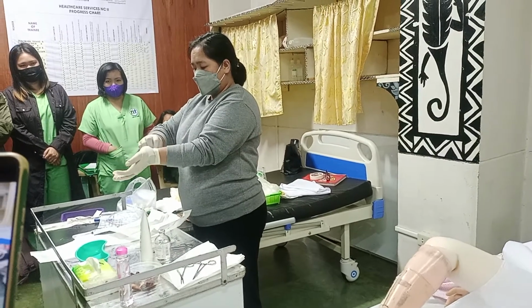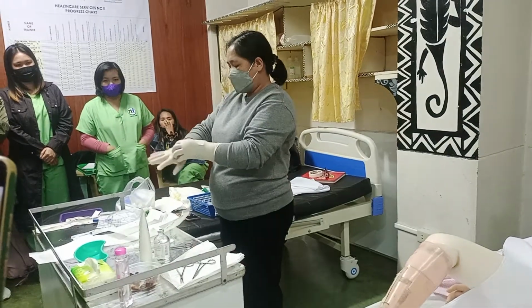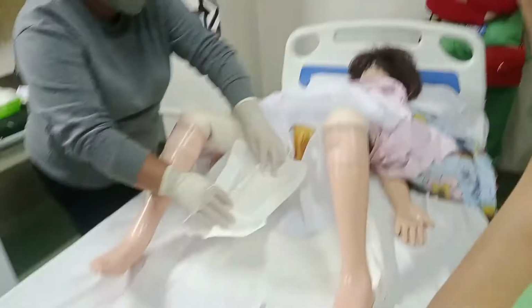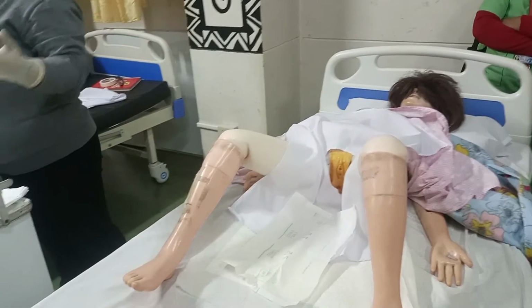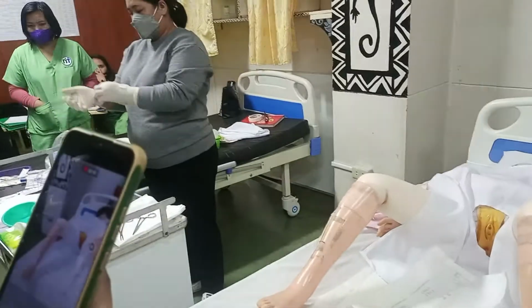Doon lang kayo sa loob humawak. Okay. Fix it. Hold the middle of this. Sa loob lang din kayo humawak. Siya ang gagawin kong sterile field kasama ni fenestrated drape. Now, dahil siya ay sterile na, ma'am, paserve ako.